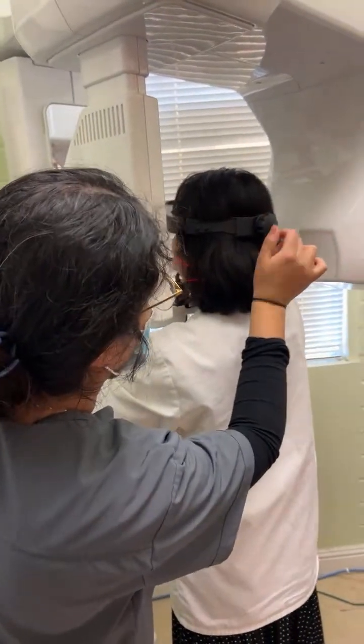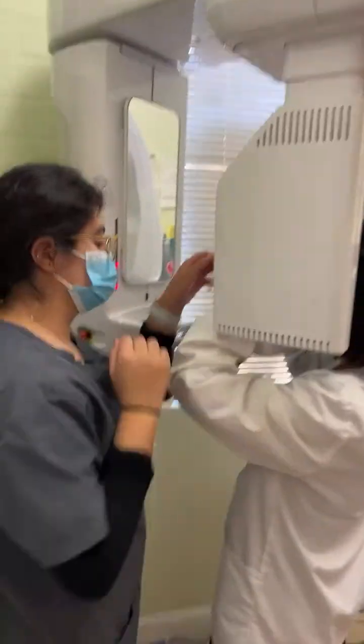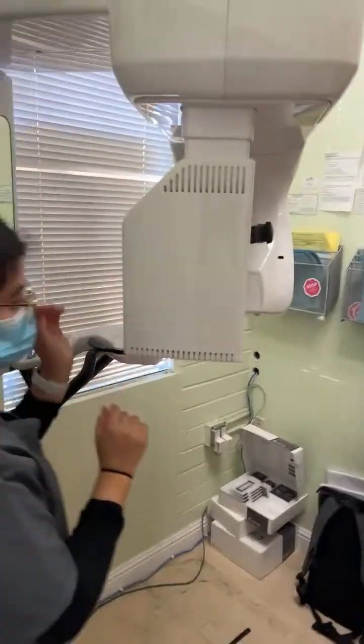Perfect. Okay. Okay, so we're gonna do a 3D. All right. You need to come over here. Yeah.